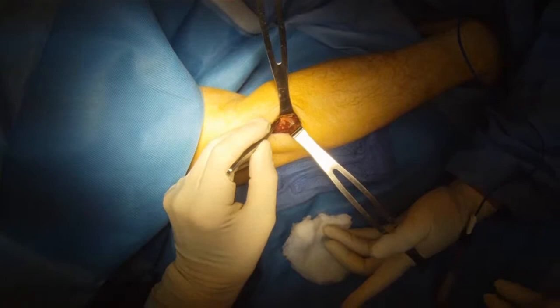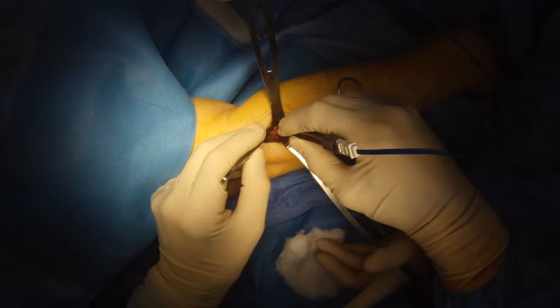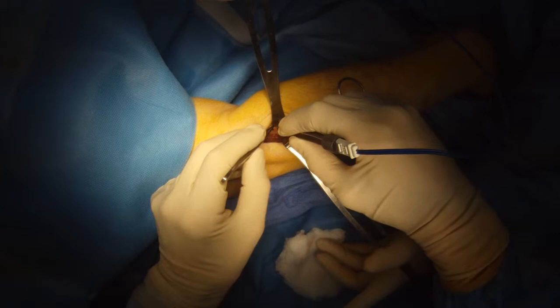So we'll use this special electrocautery device, which allows us to cauterize and cut through the veins without bleeding and without disturbing the underlying nerve. We pulse very quickly to make sure that no electricity gets to the nerve — you can see the vein in there.